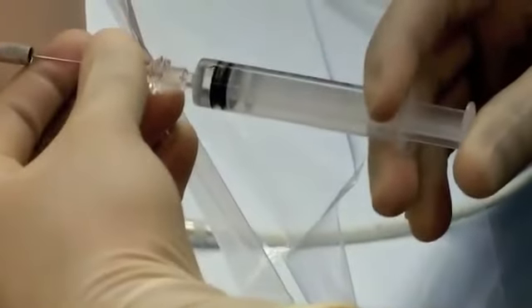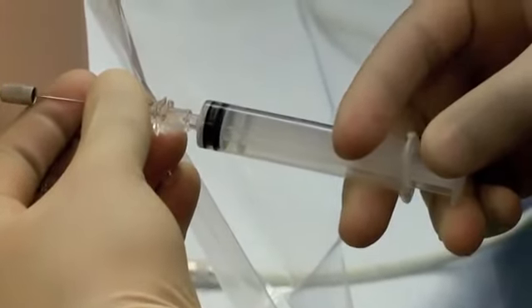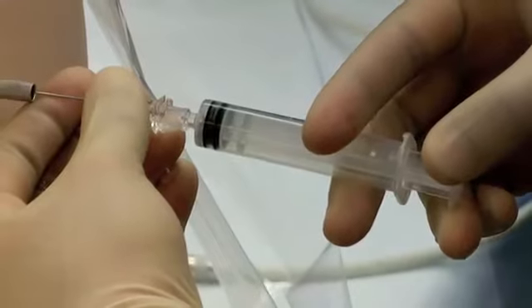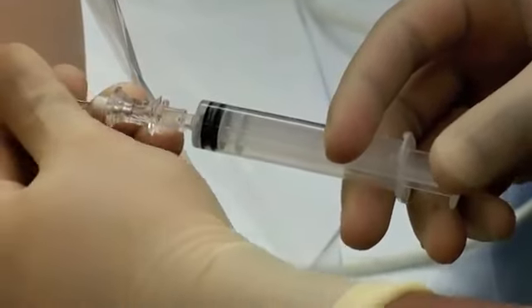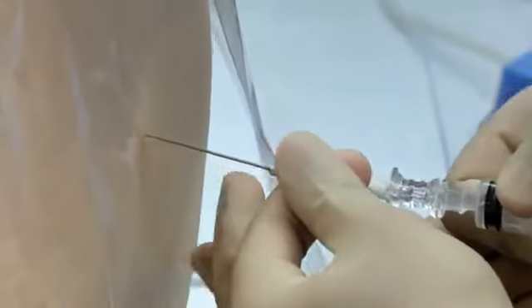And then at the very end, after injecting, I'm going to aspirate one more time to confirm I'm in the CSF space. And I am. And all at once, I'm going to pull out the introducer needle, the spinal needle, and the syringe. Apply pressure with the provided 2x2 gauze, assess for good hemostasis, and apply bandage.